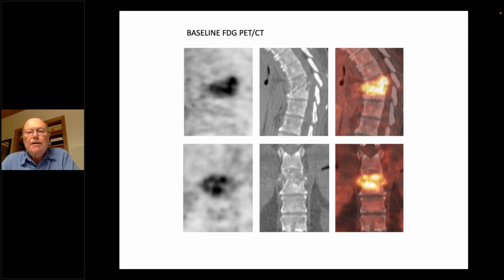And here's a typical case of active spine infection. The disease is often indolent. The presentation is non-specific, and many of the patients have comorbidities that make clinical diagnosis even more difficult. So by the time the patient presents, the disease is typically quite advanced.